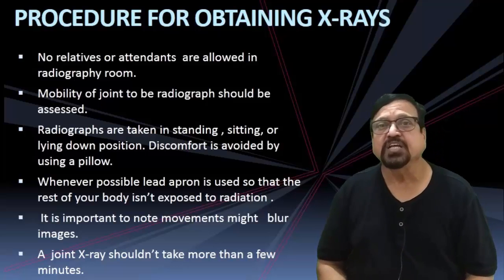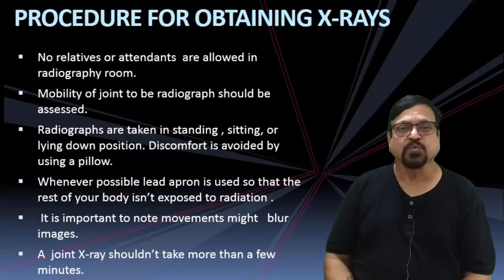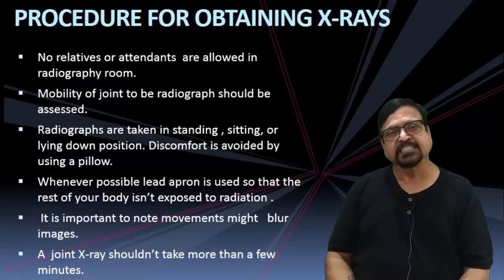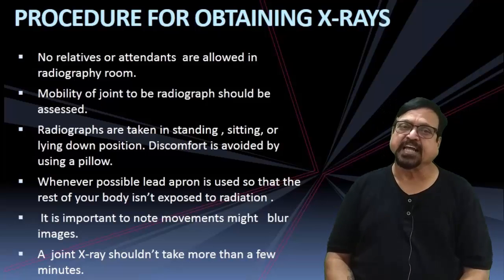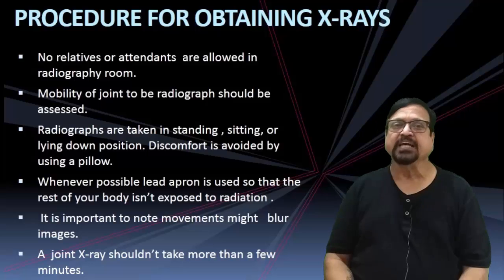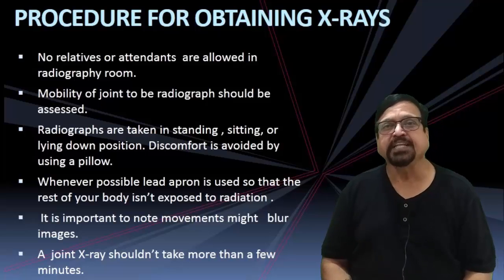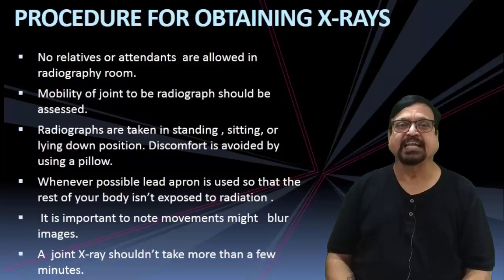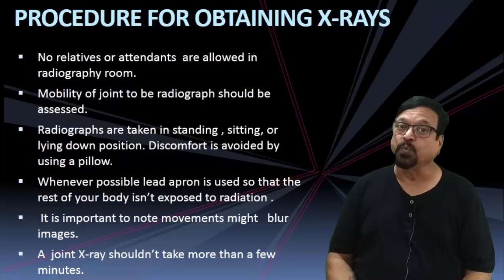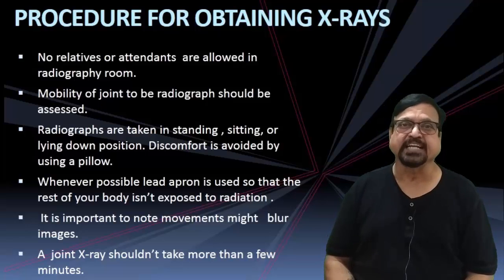The relatives should not come in the room because really there is no need to expose these people to radiation for no risk. So usually the patient alone comes in the radiography room. Relatives are not allowed. The mobility of the joint to be radiographed should be assessed before. That is to avoid pain, and if there is pain, the patient may move. So we have to assess the mobility of the joint before going for the X-ray.